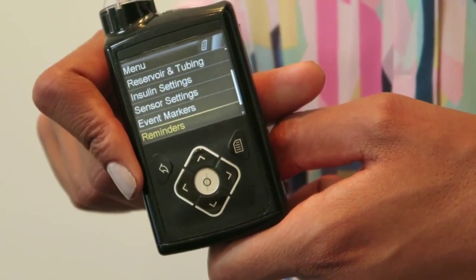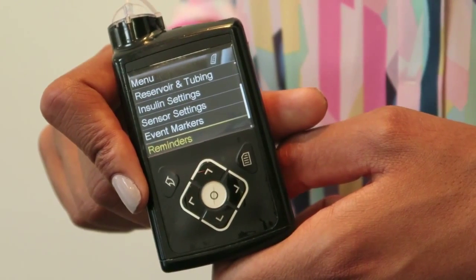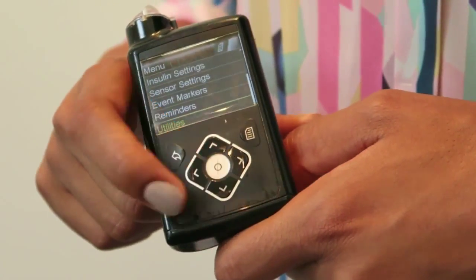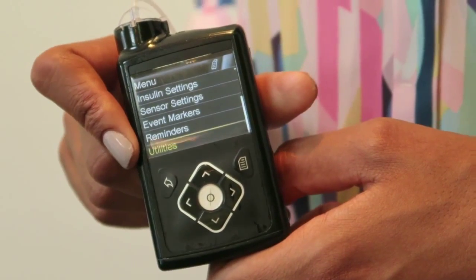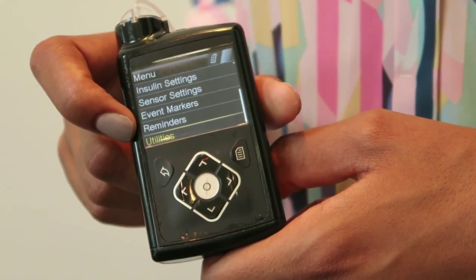Then you've got reminders. So if you wanted to remember, for example, to test after a high or a low blood glucose reading, this option just gives you a reminder on the pump to do that. And finally, you've got the utilities — similar to what you'd find on a mobile phone, you can choose how long the pump is lit for or change the time and date.